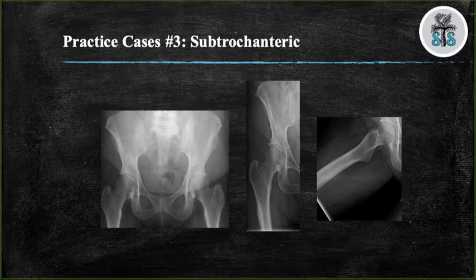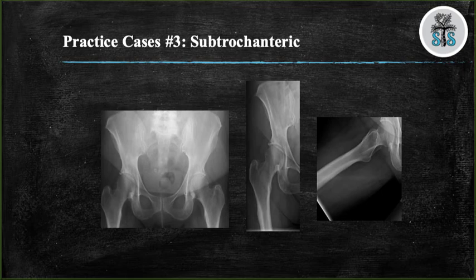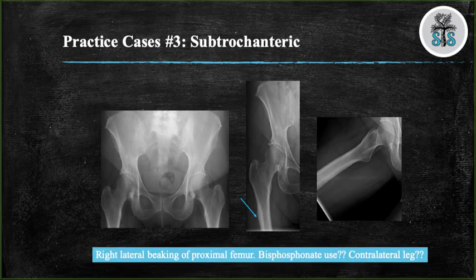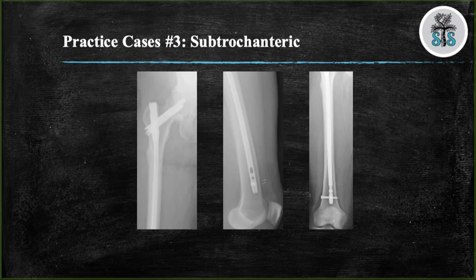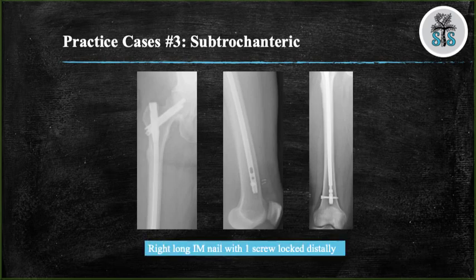Case 3. Did you see the lateral cortical beaking on the right proximal femur? Did you ask yourself whether this person is on bisphosphonate medications and whether they are having symptoms on their contralateral leg? If I were reading this x-ray, I would say we have three views: AP pelvis, AP right hip, and frog leg lateral of a right hip, demonstrating right lateral cortical thickening without fracture. You would first want to ask the patient if they were having any symptoms. In this case, the patient was having pain, so the patient was treated with a long nail locked distally with one screw. This patient had negative femur films on the contralateral side without any thigh or groin pain.